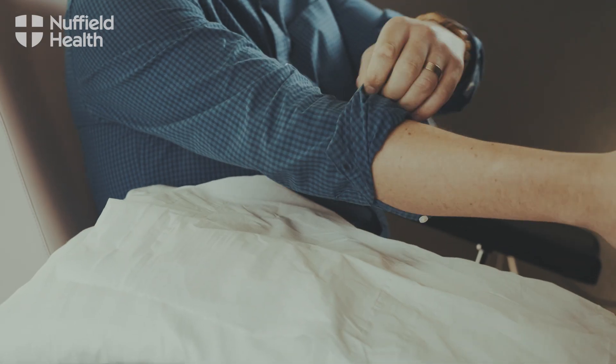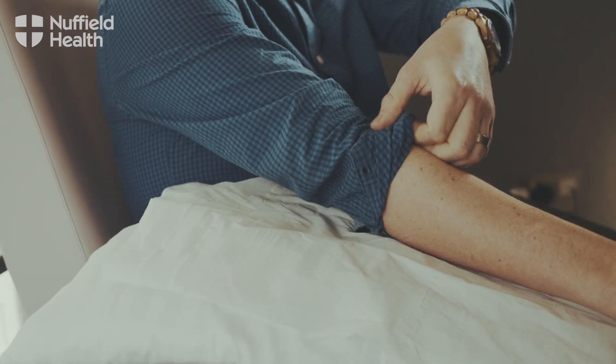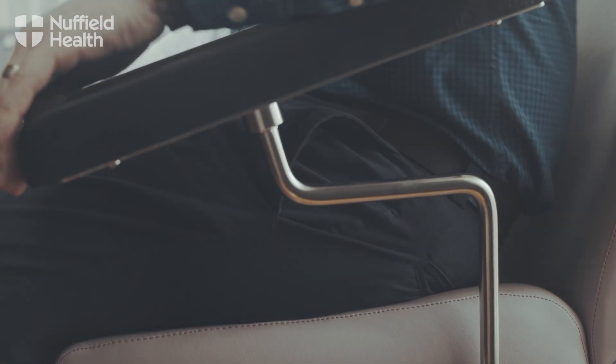My name's James Stebbing, I'm one of the oncology sisters at the Guildford Nuffield Hospital. The first step is to assess the veins when the patient comes in. We have a nice comfortable chair — usually the patient knows which arm seems to be better than another one.